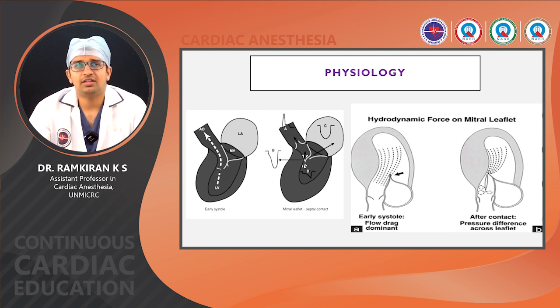So ultimately all this results in SAM leading to the LVOT gradient. The SAM severity is directly correlated with higher LVOT gradients.